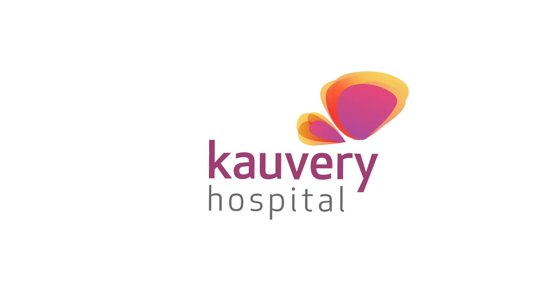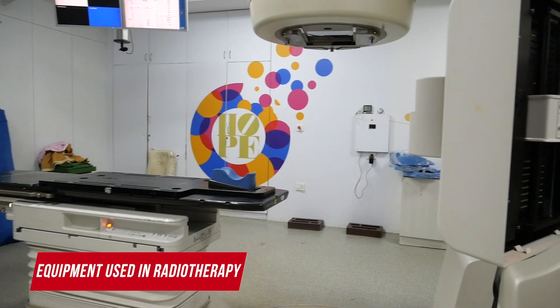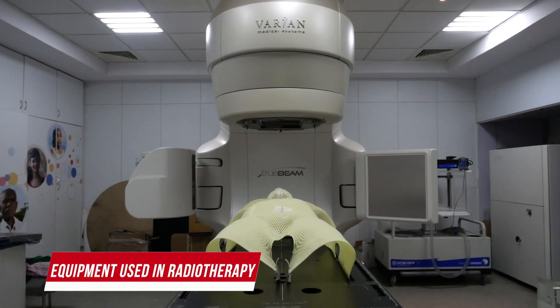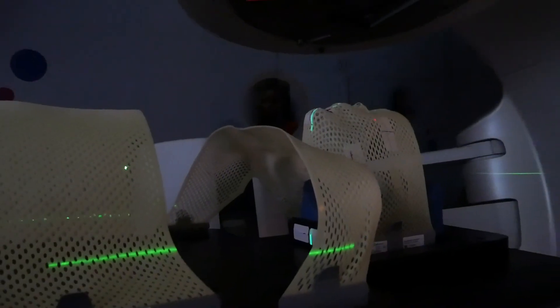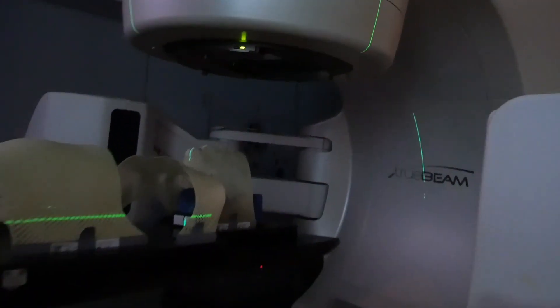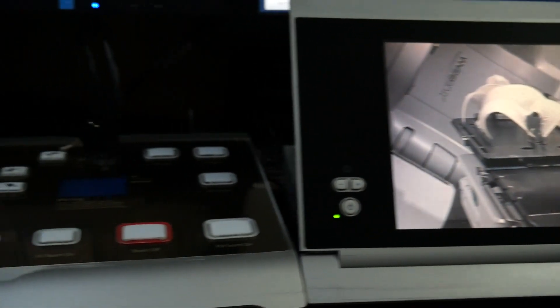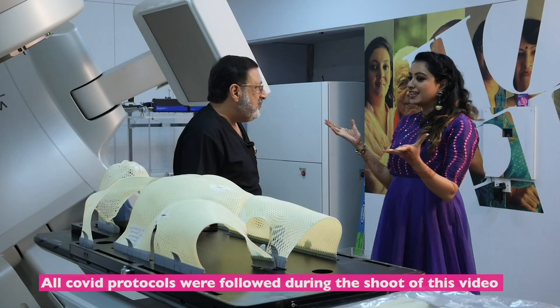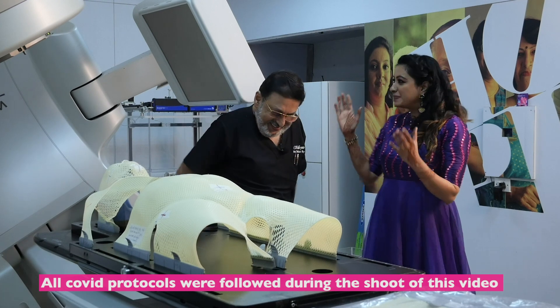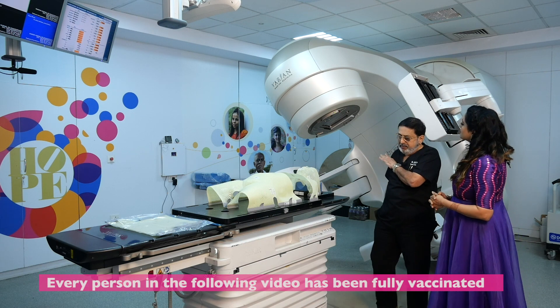Thank you for joining us. Please explain what is this. This is a linear accelerator, actually. The name is called TrueBeam, a dual energy machine with electron energies.